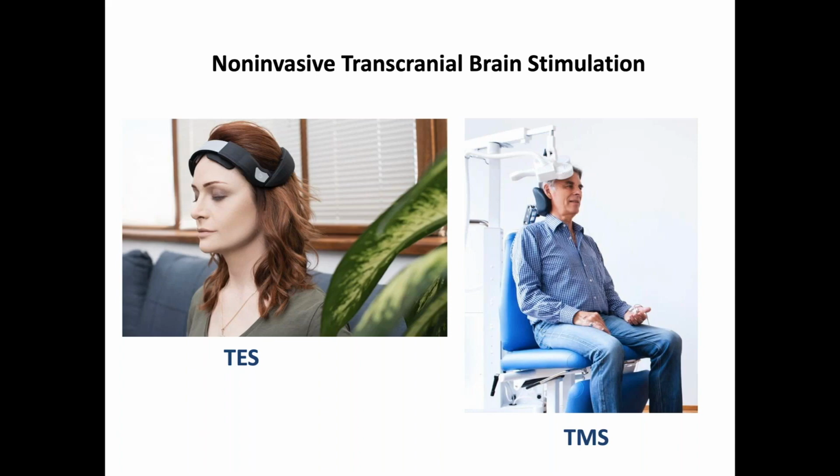And of course, those are interesting effects and protocols for clinical purposes, where you want to treat a disorder that is associated with a certain pathological hypo or hyperactivity in the brain. And you can counteract this using a respective protocol that will increase or decrease activity in those networks affected by the disorder, and change neuroplastic mechanisms on the synaptic level that are outlasting the stimulation itself, so they have lasting effects. So this is in principle, in a nutshell, what transcranial brain stimulation can do.